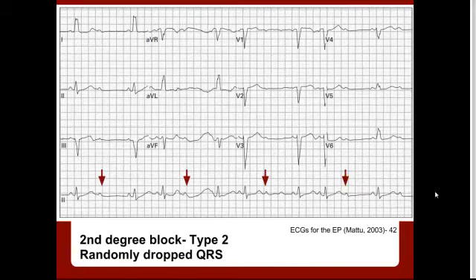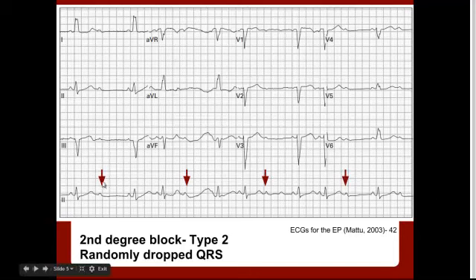In this example of a second degree block Type 2 — case 42 in the book — this is where you're going to have randomly dropped QRS waves. Pointed out with arrows: here's a P with no QRS, here's a P with a QRS, then P, QRS, then P with no QRS. There are just these randomly dropped ones, highlighted with the red arrows. That would be a second degree block Type 2.